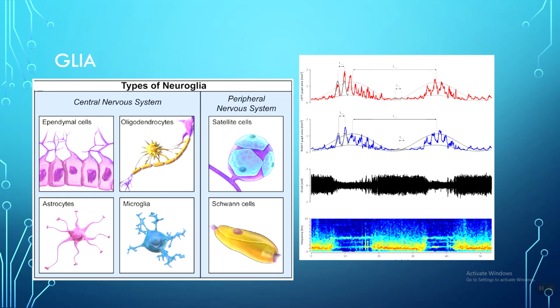And on the right is a picture of slow cortical potentials. And so a slow cortical wave is something that you can't track generally in a raw EEG. It is so slow and so large that it's indicating a different thing. It's not the firing of a neuron like most of the other frequencies. It is the hemodynamics of the brain that have to do with the metabolization of the blood glucose. Slow cortical potentials. So everything beneath 1 hertz.